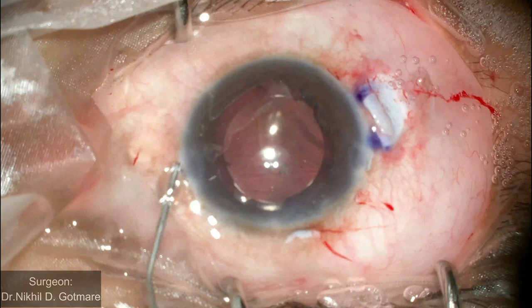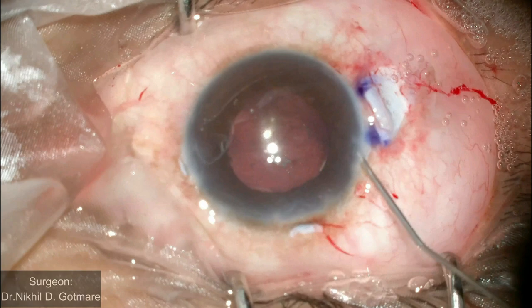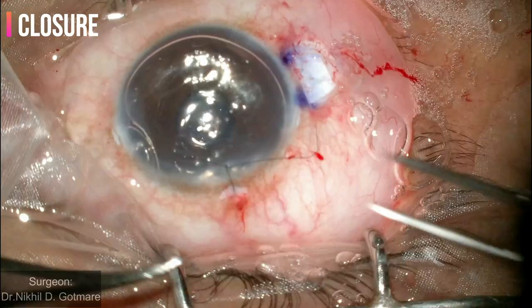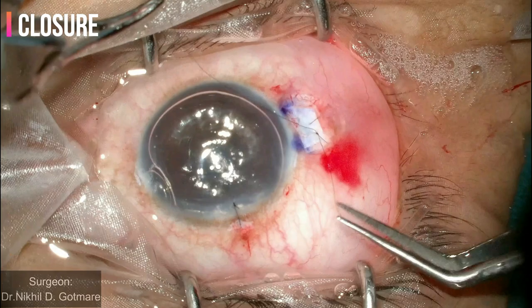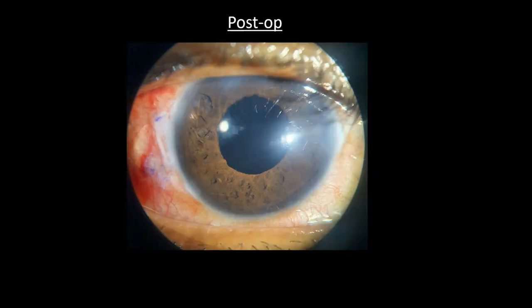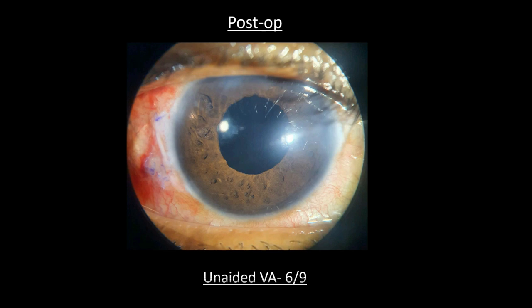Viscoelastic is removed. Pilocarpine is injected. Ports are hydrated. As the AC appears a little shallow, a 10-0 nylon suture is applied on the main port. The scleral flap is sutured using two 10-0 nylon sutures. Conjunctiva is closed using 8-0 vicryl. This is the post-operative picture of the patient — the IOL is well centred and the patient had an unaided visual acuity of 6/9.